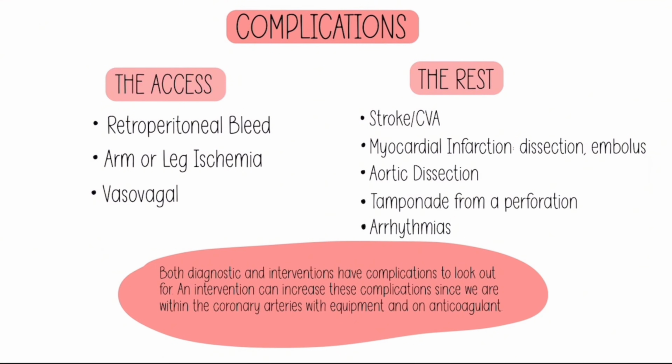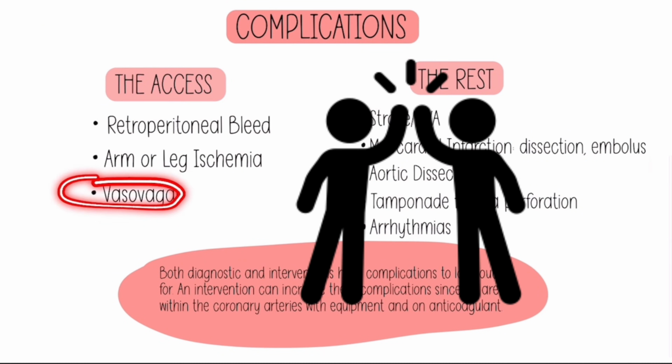I always like to have somebody else there with me, even if I'm very comfortable, because if something like this happens, you can't do anything, right? You're holding pressure in the groin. If they need medications, you have to continue to hold hemostasis. They're going to bleed. So it's very, very good to have a second person in the room watching you, just in case.